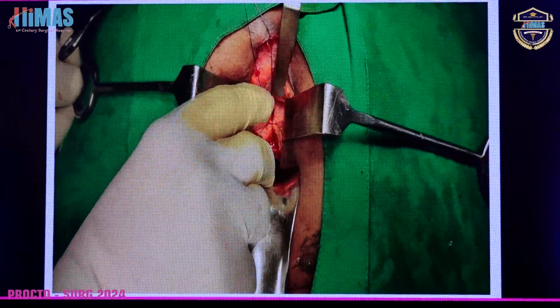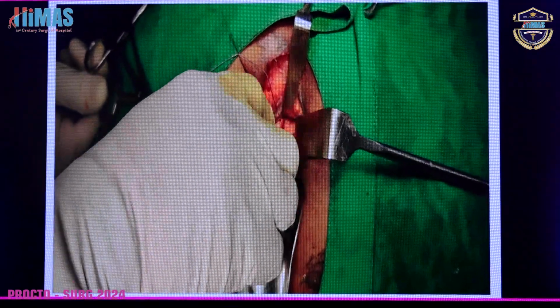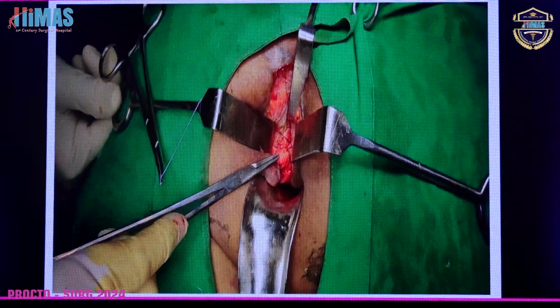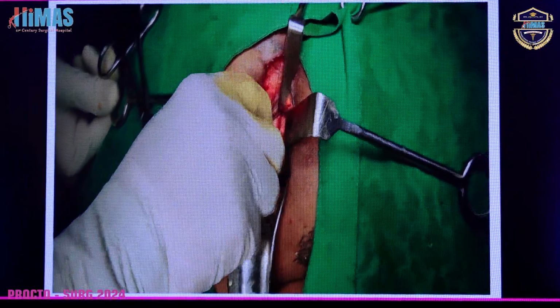and then you will have to remove it. And there also the crux lies, you should preserve the anorectal ring at any cost, because in case that is divided, that will lead to a havoc in your surgery. Even recurrence is acceptable, but incontinence is never acceptable by any patient.